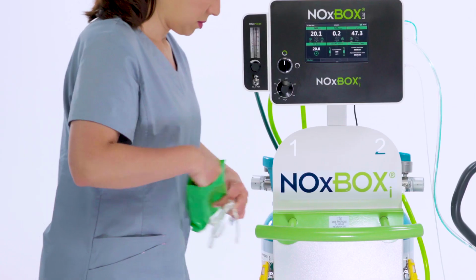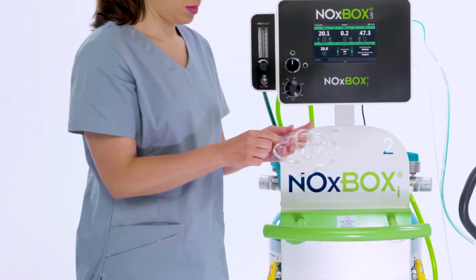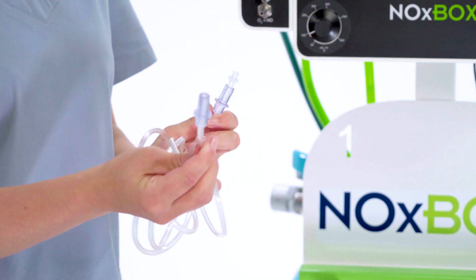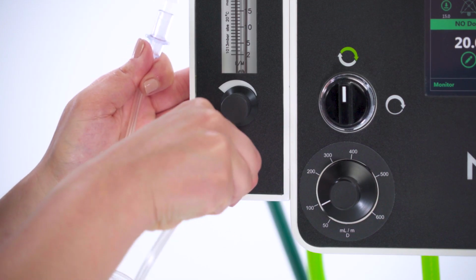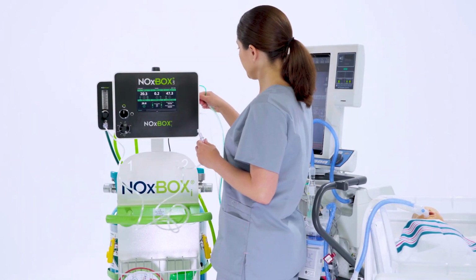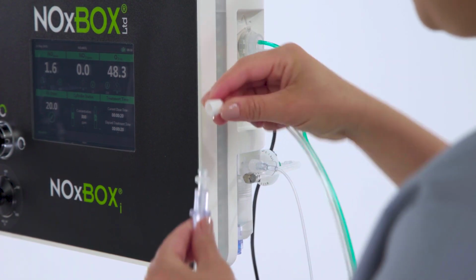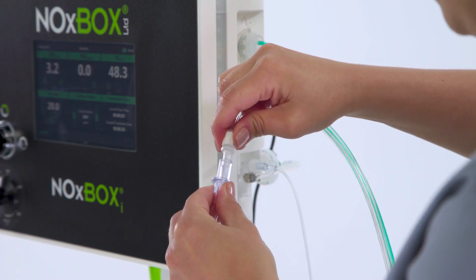Remove the NOxBOXi emergency backup kit from its packaging and assemble the luer connection. Connect the tubing to the NOx mixer outlet barb. Remove the nitric oxide dose line from the port on the NOxBOXi device and connect it to the emergency tubing using the luer lock.